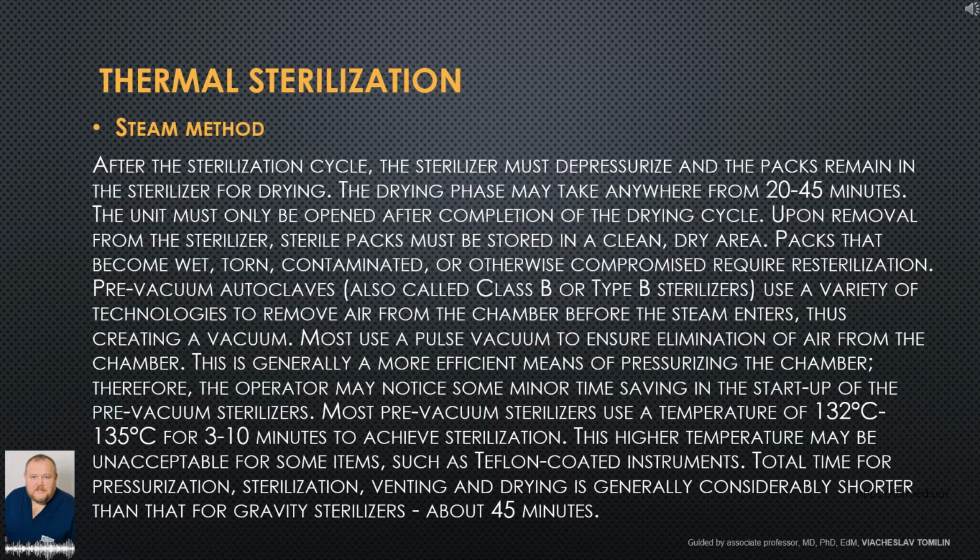After the sterilization cycle, the sterilizer must depressurize and the packs remain in the sterilizer for drying. The drying phase may take anywhere from 20 to 45 minutes. The unit must only be opened after completion of the drying cycle. Upon removal from the sterilizer, sterile packs must be stored in a clean, dry area. Packs that become wet, torn, contaminated, or otherwise compromised require re-sterilization.